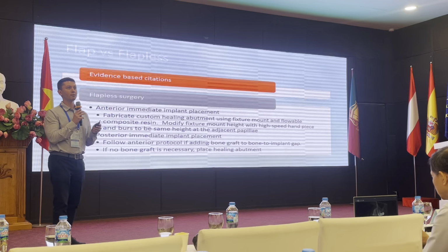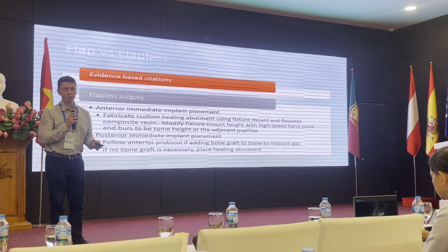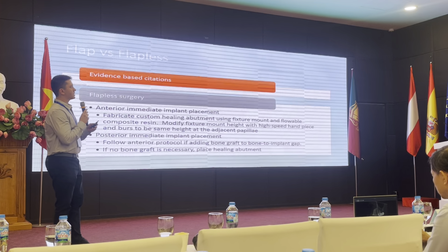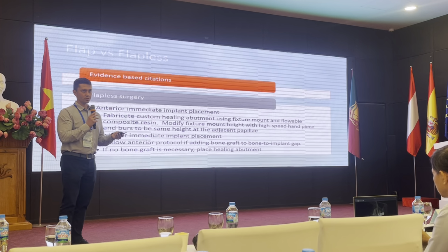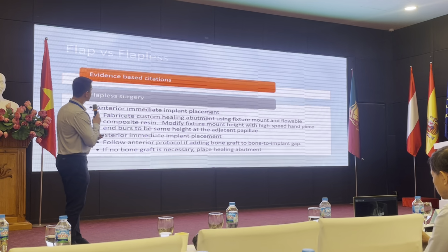Are we going to achieve primary stability? Are we going to use resorbable sutures? Are we going to use non-resorbable sutures? What's our material of choice, and plan in advance?